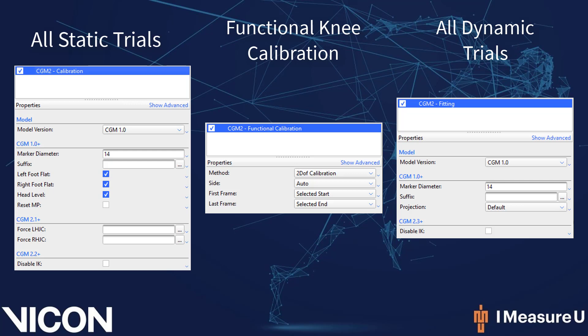Just as a general note about these pipelines, you'll see that CGM2 calibration and CGM2 fitting both have their properties and sections. This allows a user to pick settings that apply specifically for the model they are using. As an example, if a user is using CGM2.1, they can choose from settings relating to CGM1.0 plus and CGM2.1 plus. Making changes to the settings within CGM2.2 plus will have no effect. As each operation has its own set of properties, I will run through these individually.